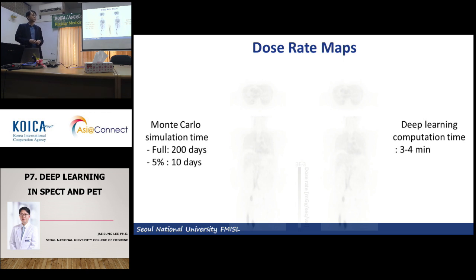Because dose rate and voxel-based dosimetry. That dose rate means absorbed dose. Ah, the physical dose, I mean, the physical dose. Actually, I supposed that you are at first making an activity map and then calculating the S value, putting in the S value.